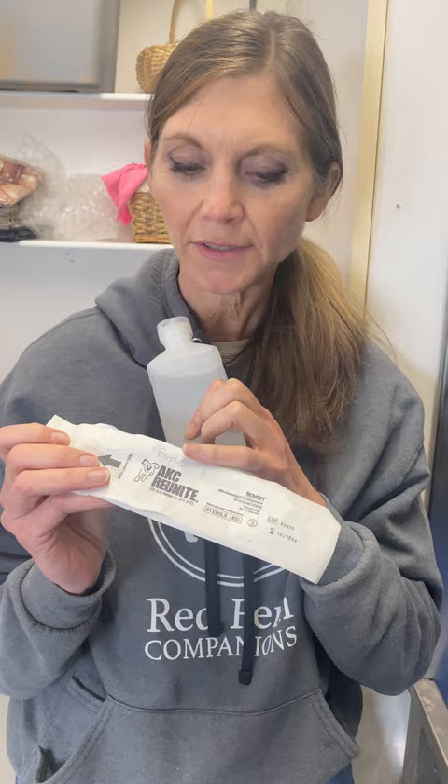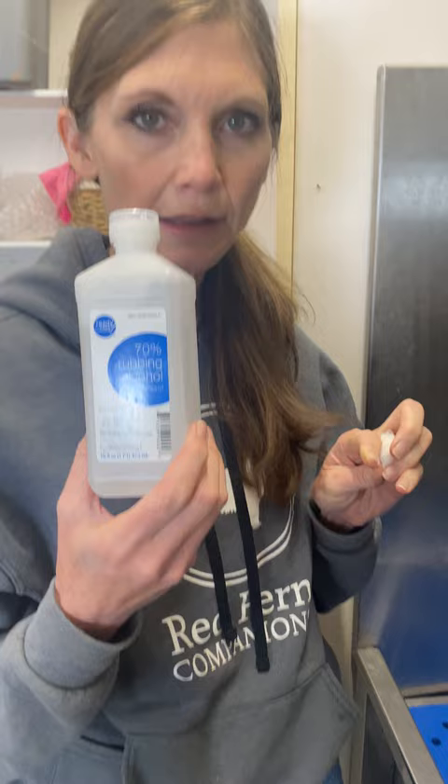We are putting a microchip in today. I've got the microchip — I use the AKC Reunite, I order those from AKC. And you'll need alcohol and a cotton swab.